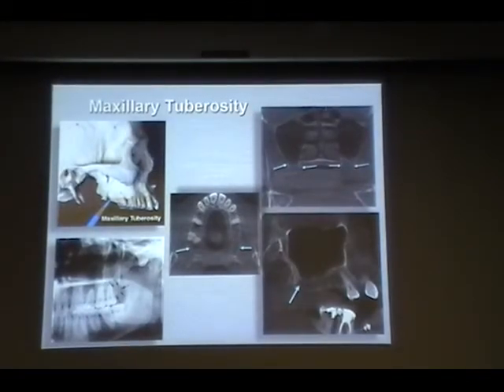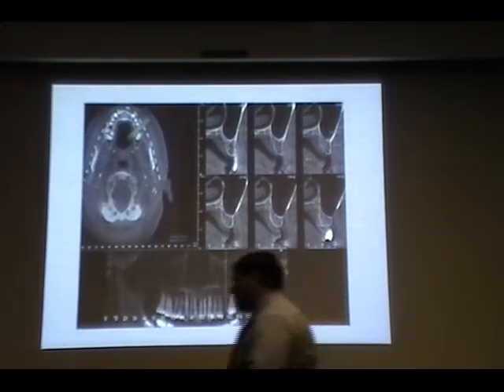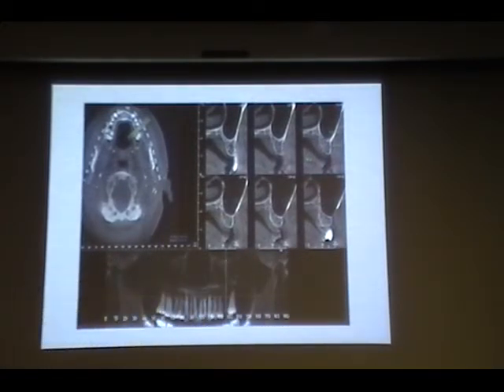We talked about the maxillary tuberosity, right? So you have to be careful not to break it. Here is an example, yes? Are osteomas likely to only become malignant? No, no, at least I haven't seen. Okay. So, oma, that is the benign one.